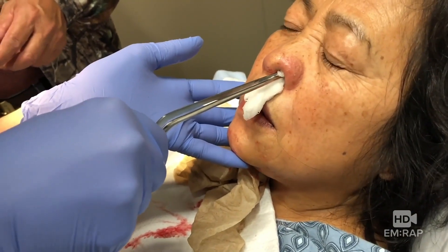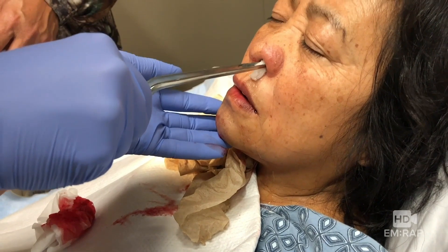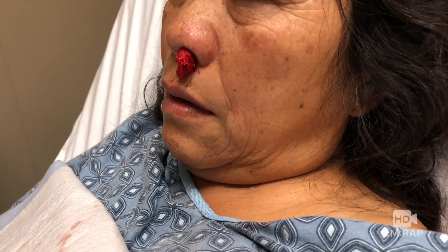This is going straight back — not up, not to the brain. It's going along the hard palate. It's surprising how much space really is in the nasal cavity. We're basically going to insert this all the way and then let it sit there. She bleeds through it and that's okay — just leave it in and start the timer.